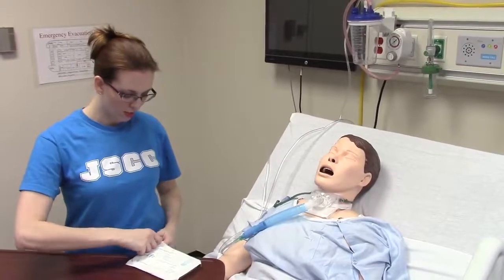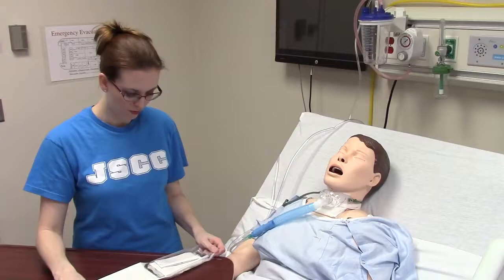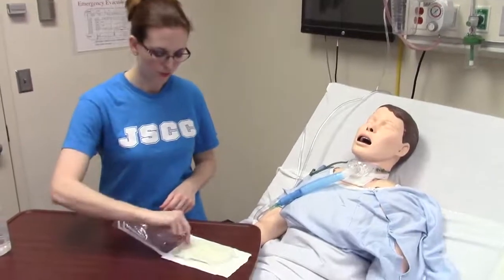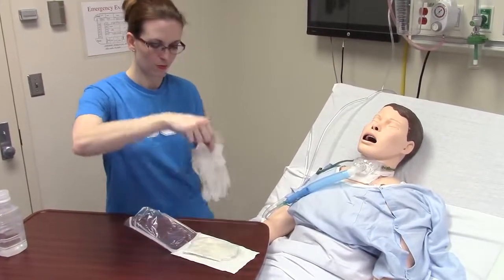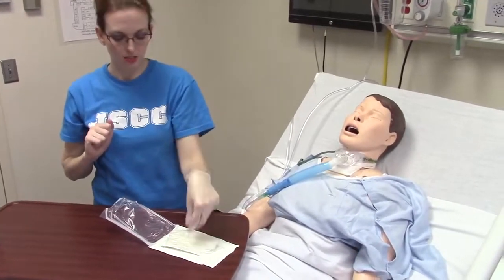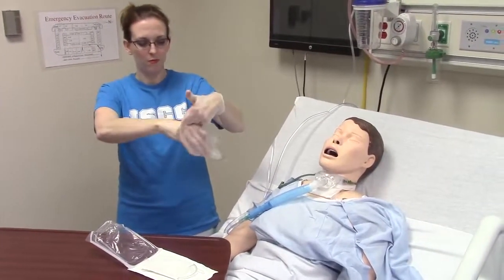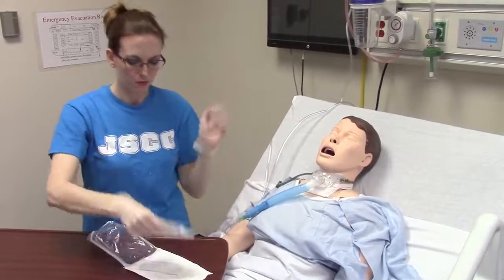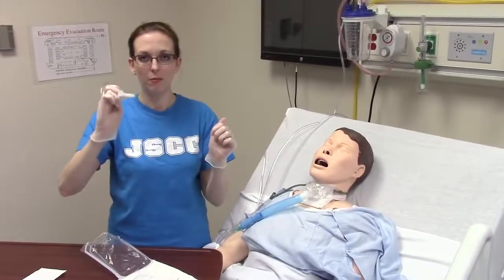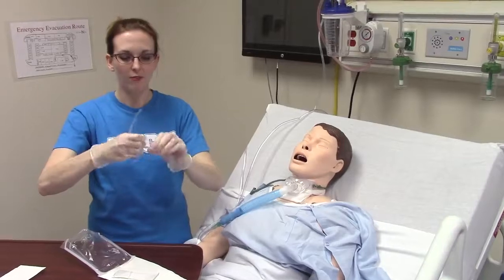I'm going to open this away from me. This one has the gloves on the bottom side, so I just flipped it over. They were kind of stuck together so I touched that end, which means it is non-sterile — I can't touch that. This is the suction catheter itself. I'm going to loop this up in my dominant hand. You can loop it around your fingers or gather it up any which way you want; this is just how my practice is.